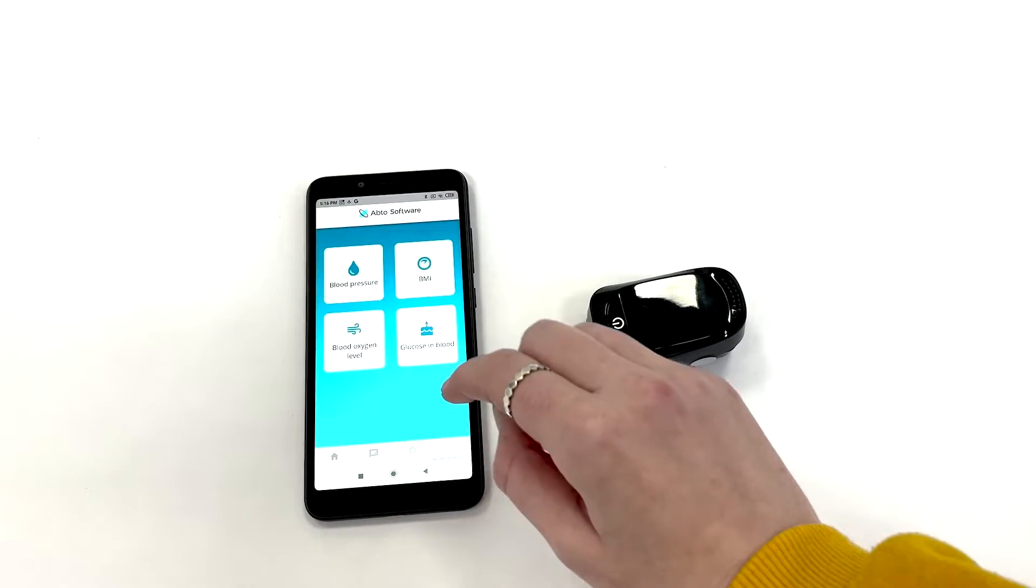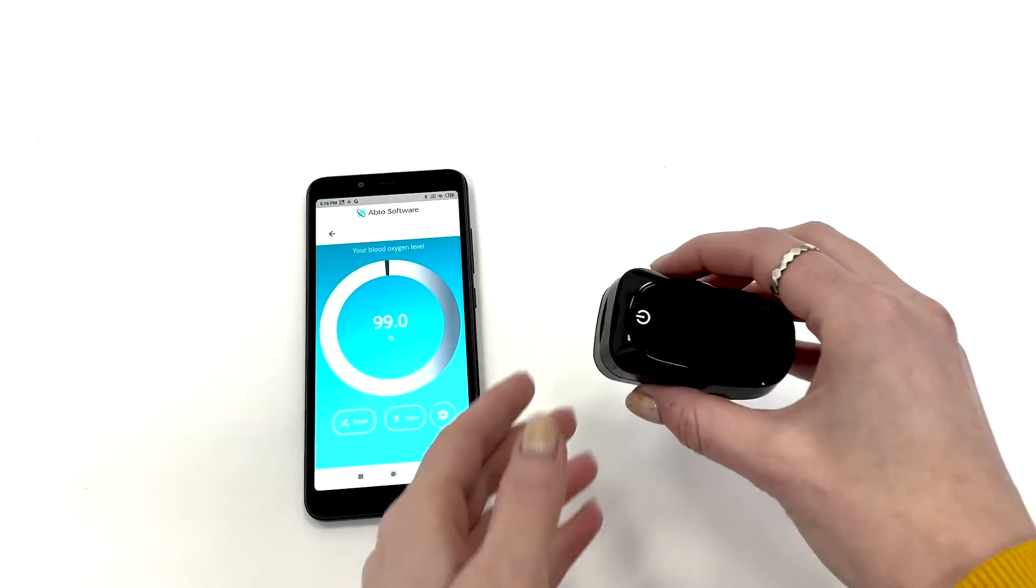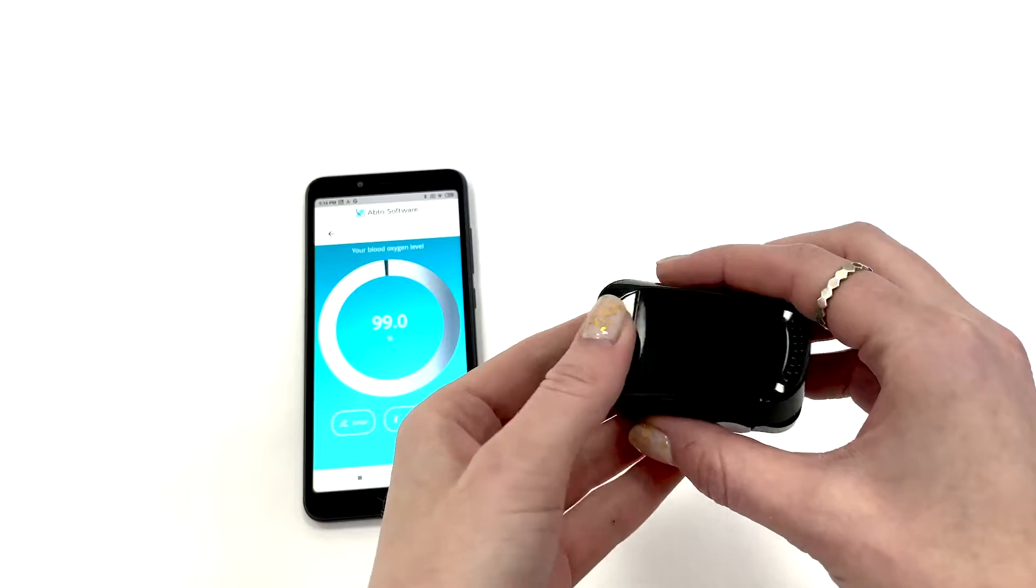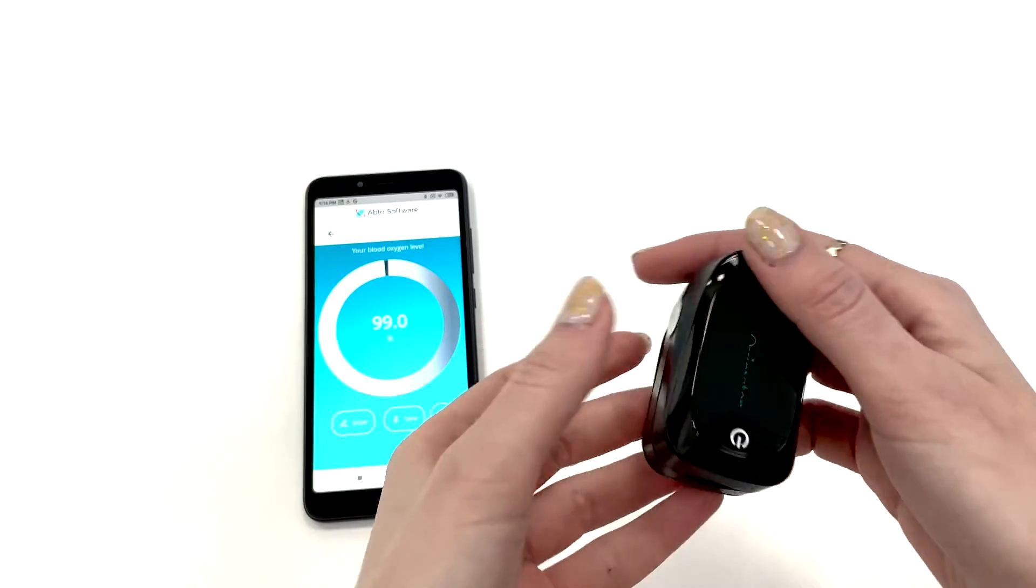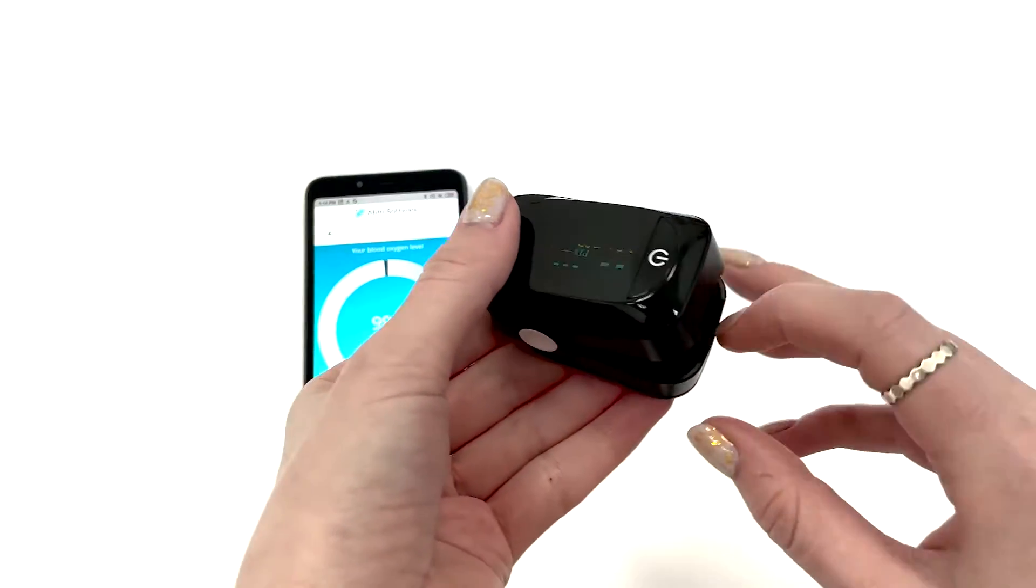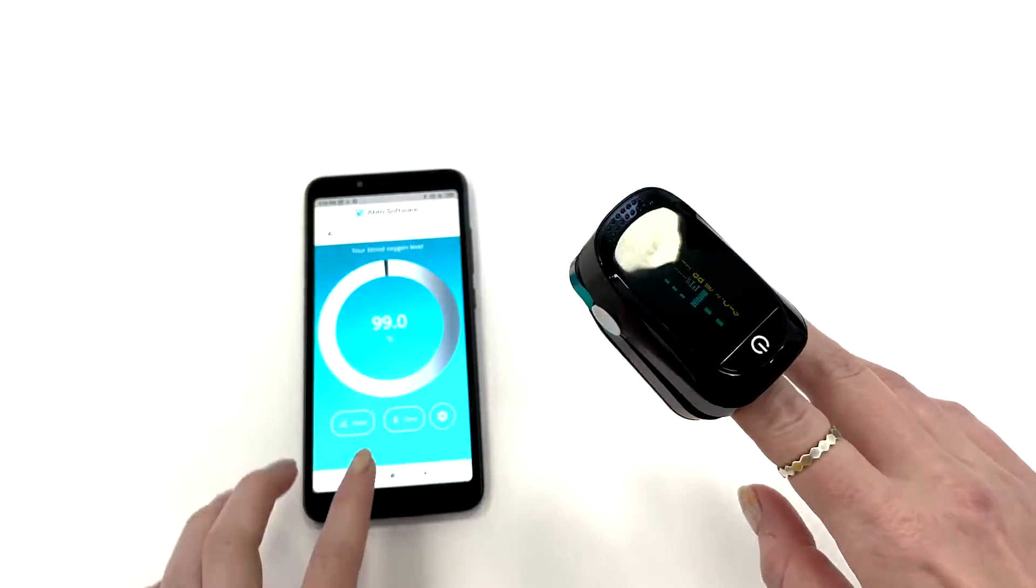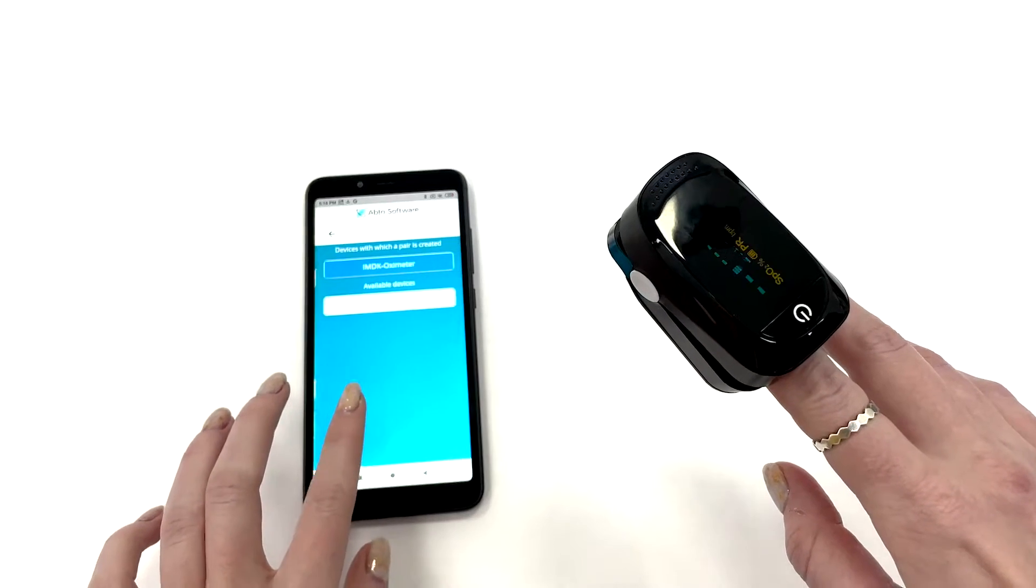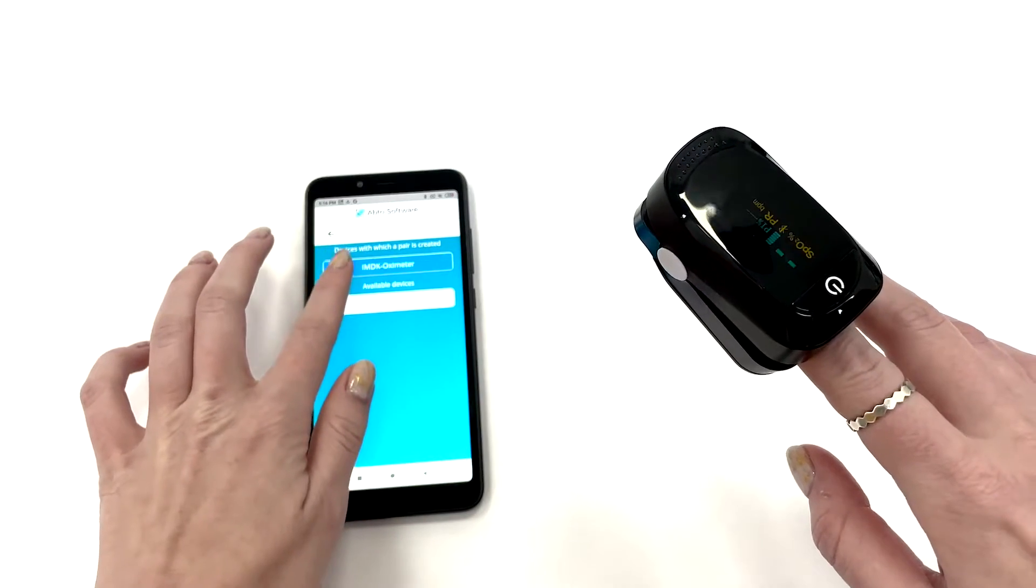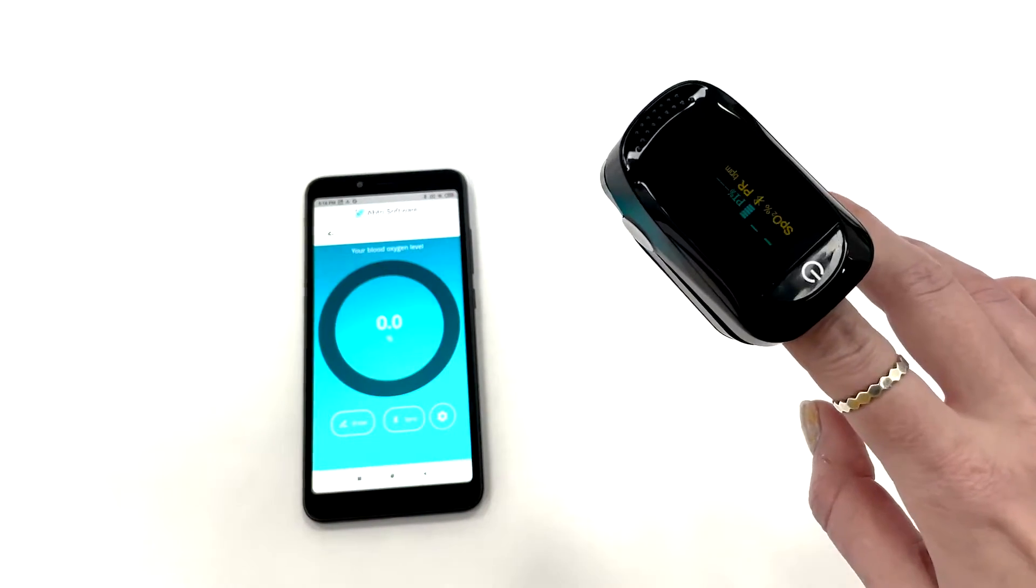When opening the menu, we can choose between the indicators we want to measure. Let's start with the blood oxygen level. Select the desired category in the application's menu, synchronize the application with nearby devices when Bluetooth is turned on.